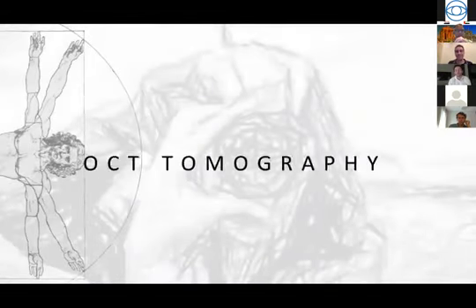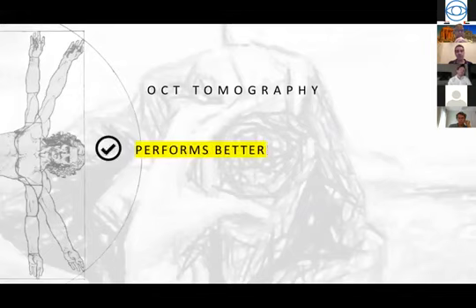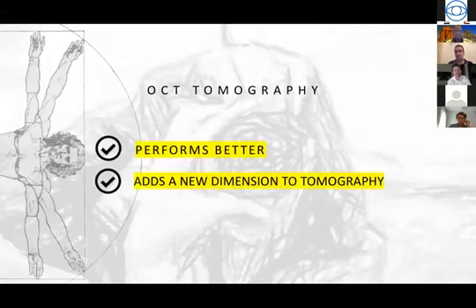we know that OCT does things better than Scheimpflug, and there are many things that OCT does that Scheimpflug does not. That's why I think it is important in your routine, out-of-the-mill tomography evaluations, pre-op, post-op, and at all levels.